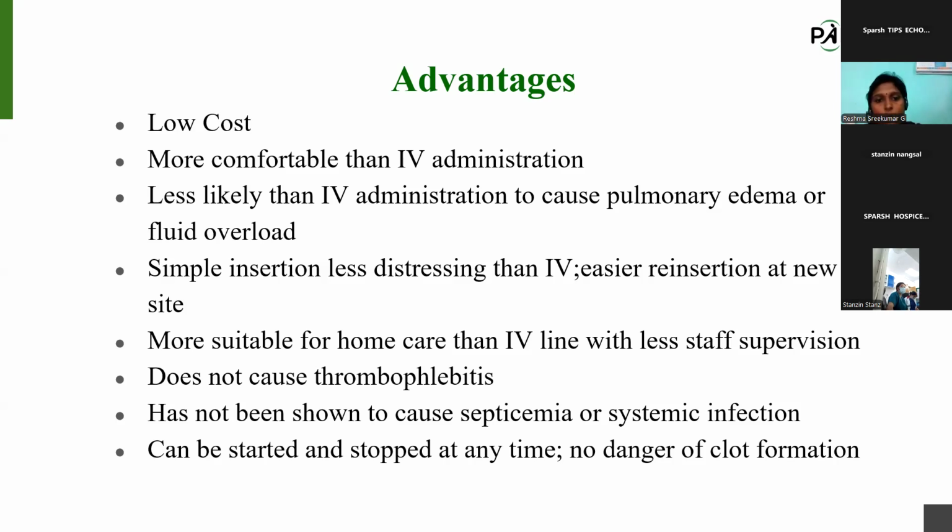It is very low cost. It is more comfortable than IV. It will not cause pulmonary edema or fluid overload. Insertion is simple, and we can easily find another site also. It is more suitable in home care settings, it needs less staff supervision, and it will not cause thrombophlebitis. The chance of septicemia and systemic infection is very, very low, and we can start and stop at any time. These are some of the advantages.